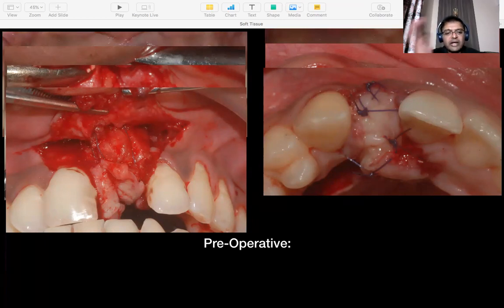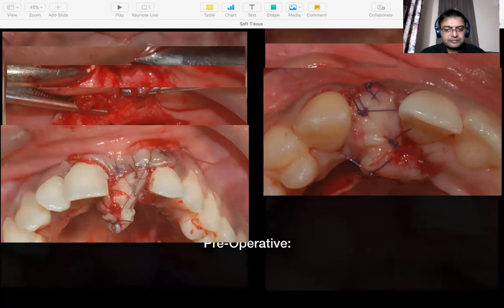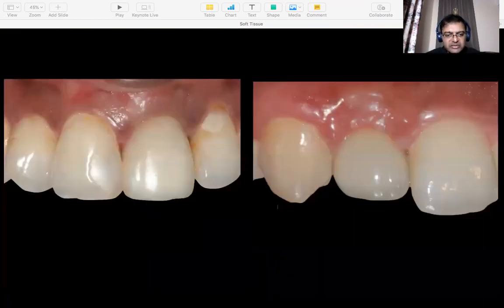Instead of that, if you rotate the palatal flap like a pedicle, okay, and seal it the way you see here in the picture, what you achieve is you are not touching the mucogingival junction. There's no flap advancement, and the socket also gets sealed. This is an epithelialized pedicle, and 3 months down the line, you see that the tissue around both of these implant sites heals very well. There's no change in the buccal tissue level. It's only the palatal tissue that's covering up your extraction sites.